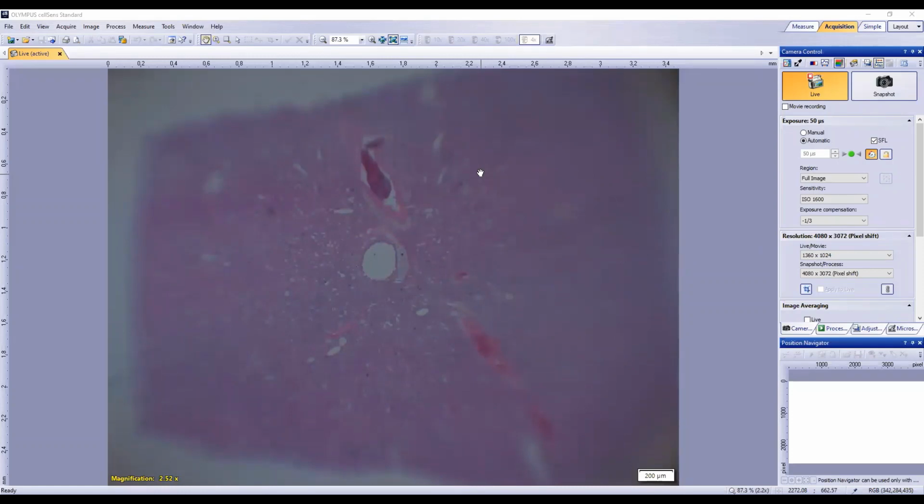So we've got what, three different types of pneumonia, basically, don't we? Interstitial, bronchointerstitial, and bronchopneumonia. Exactly. And the name sort of speaks for itself, doesn't it? Where the process is focused in terms of inflammation, and in this case, progressing to pretty much large scale consolidation.